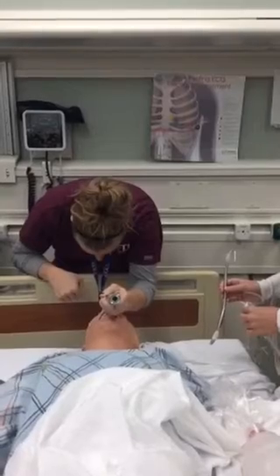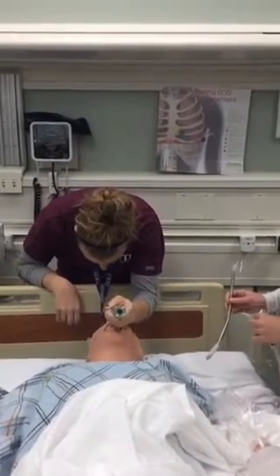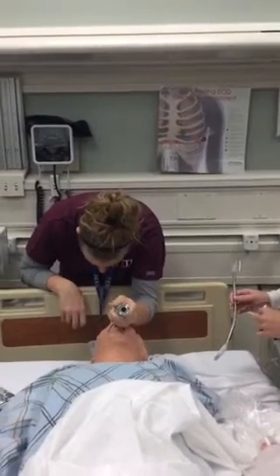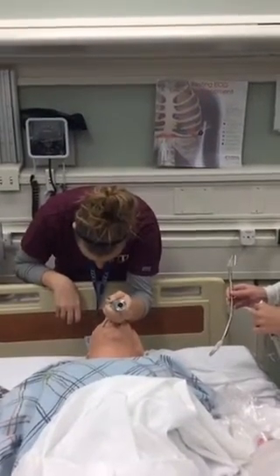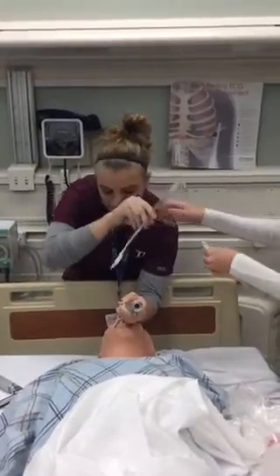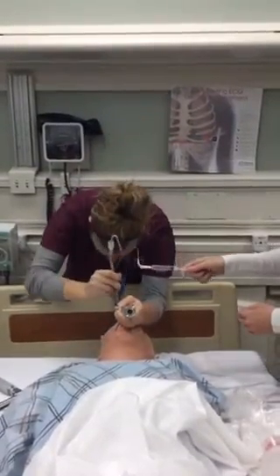With a forward and upward motion, raise the epiglottis to expose the vocal cords. The straight blade should be placed under the epiglottis and lifted upward and forward to expose the cords. As the cords are observed, advance the ET tube approximately 2 centimeters past the cords.